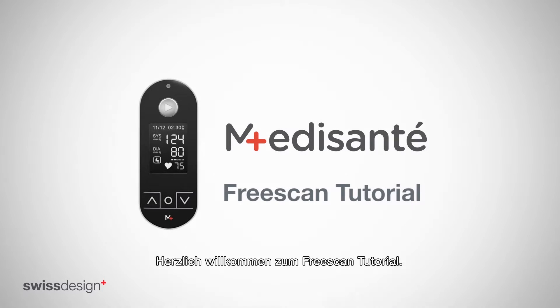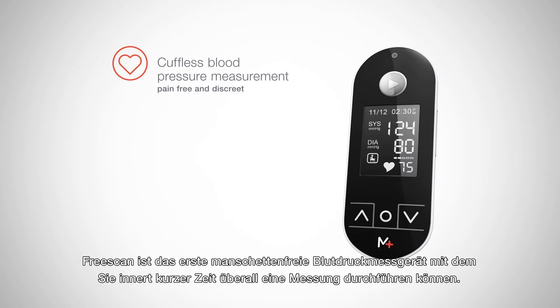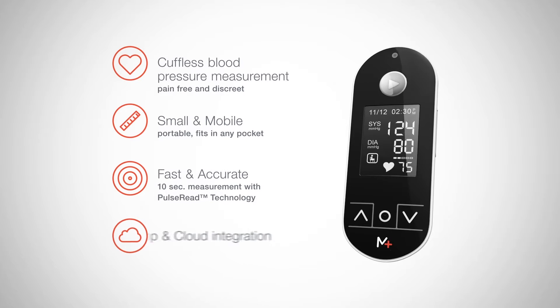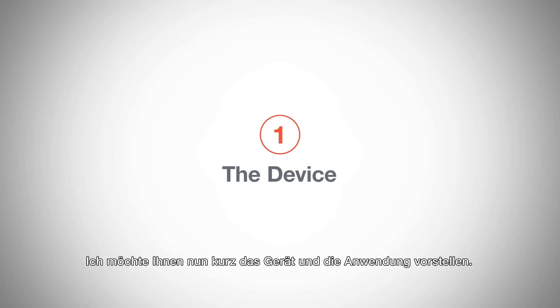Welcome to this FreeScan tutorial. FreeScan is the first cuffless blood pressure monitor which can be used anywhere and at any time. Let me now introduce the device and show you how easy it is to use.